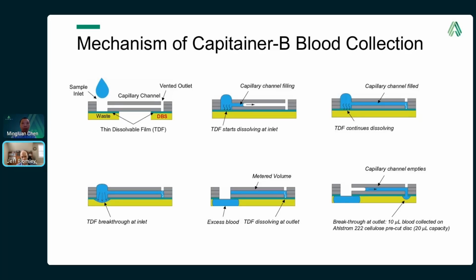And then once we have this pinch off here at the inlet capillary microchannel, the TDF at the outlet then starts to dissolve and the microchannel volume empties through the outlet. And that's facilitated by the capillary forces that occur during absorption of blood onto the cellulose disc.